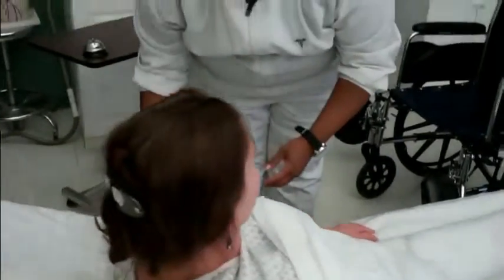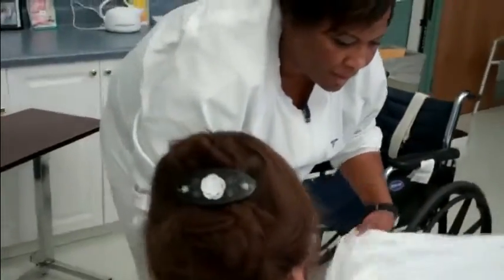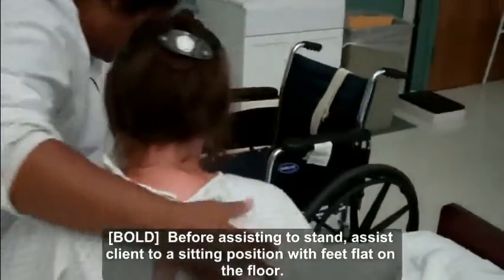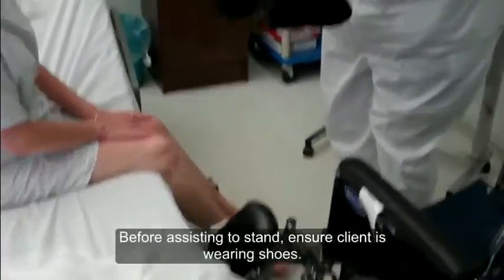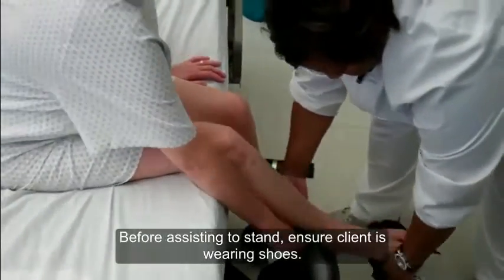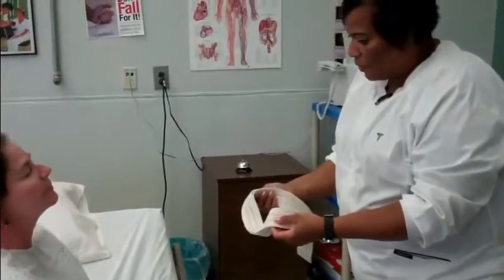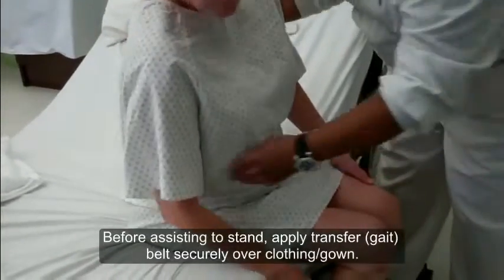I'm going to put her shoes on before I get her out of bed. I'm going to put the gait belt around your waist. Great, your feet are flat on the floor.